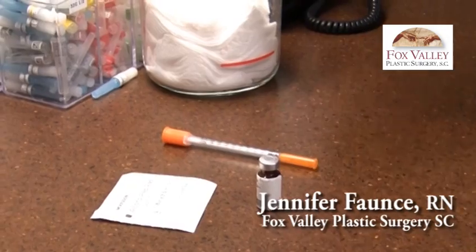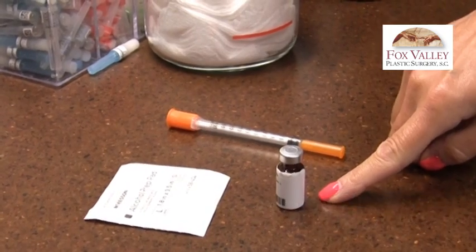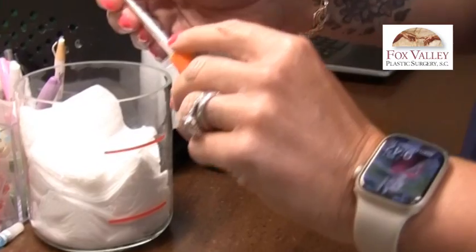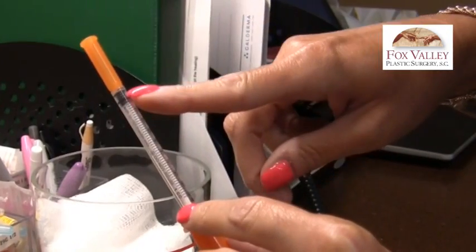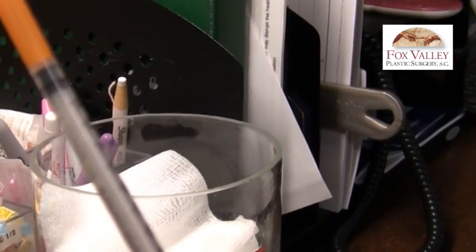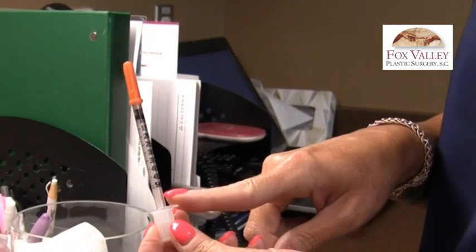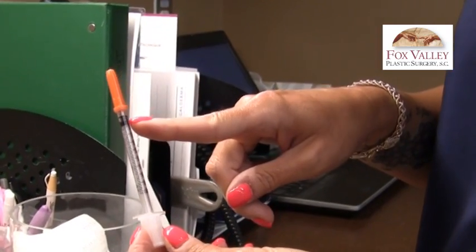When you get your semaglutide, this is what's going to come with your medication: a vial of medication, some alcohol pads, and insulin syringes. If you're picking up from our office, your insulin syringe will be a 100-unit insulin syringe, so each line on the syringe is two units of measurement. If you're getting it shipped from the pharmacy, your insulin syringe may be a 50-unit syringe, where each line is worth one unit.